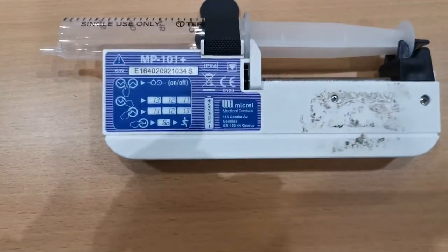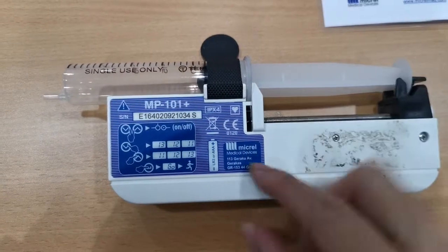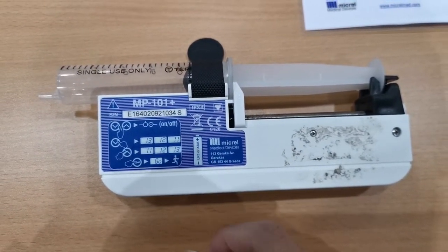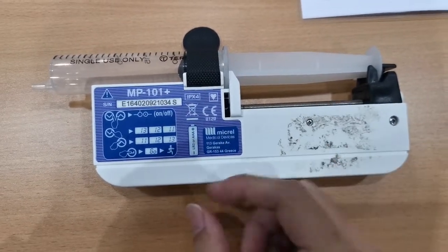We have a sticker there. Sticker there, take out. That's not a stick. That's why I got a mark. This uses AAA batteries instead of the rectangular one that I have to use.